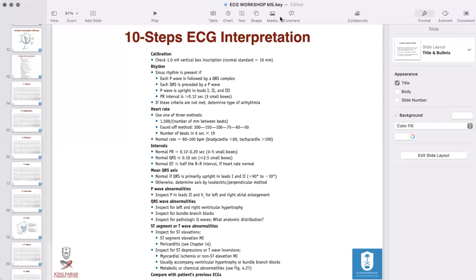And then he comes back with chest pain, and you do another ECG, and you see there is an ST elevation, but it's the same as before. Then you don't consider there's a new acute event, because that's the same as the baseline on discharge, right? So that really helps you. Okay. Yes. Thank you, doctor. My pleasure.